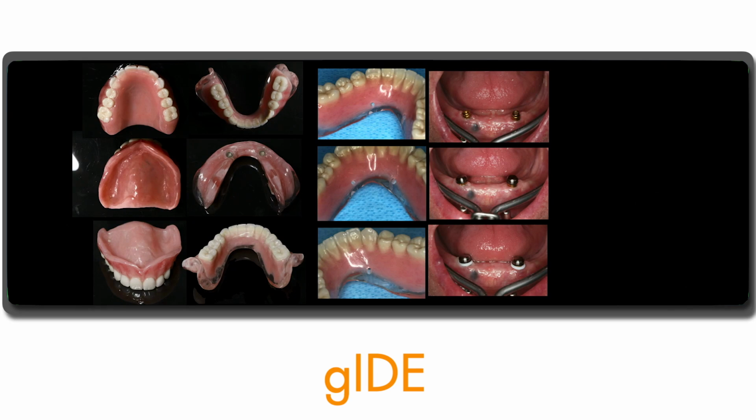So here on this image, these are the new prostheses once they're processed. You can see there's a nice lingual flange well fitting onto the retromolar pad, and also that buccal shelf region of the mandible. These are the primary stress-bearing areas, and your denture has to cover those areas to have good tissue support. We changed the locators.